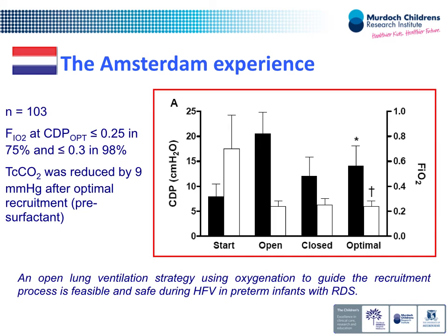The idea is not to be on a ventilator. But can I give you a randomized controlled trial in JAMA or in the New England Journal? No. So generally, what's the time frame that you guys do these? Excellent. I might move on and answer that for you.